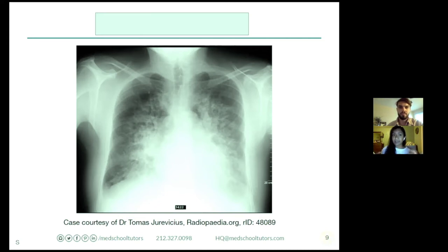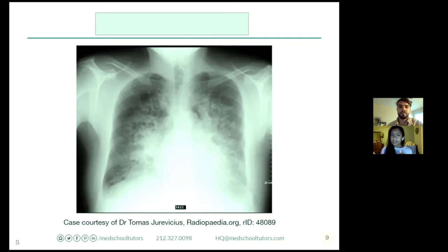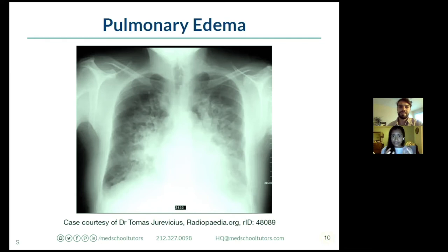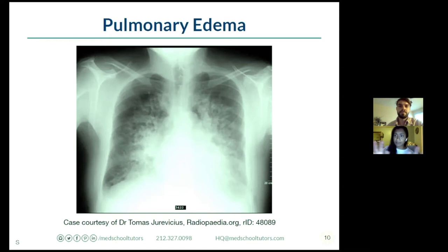Think about what's anatomically there - hilar vessels: the bronchus and the pulmonary arteries going out and supplying the lungs. Anytime you see this branching pattern, central predominant, think pulmonary edema. This is a severe congestive pattern with cardiomegaly, which also supports this process, and all of these reticular opacities central predominant branching outward.